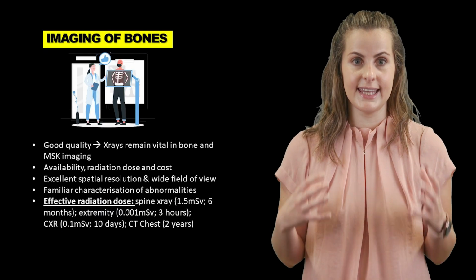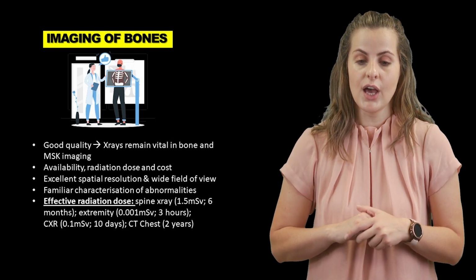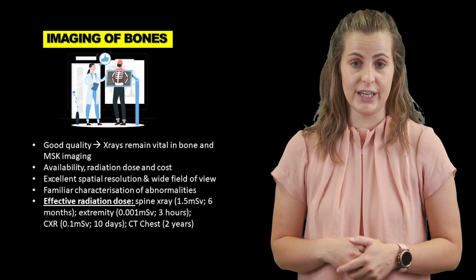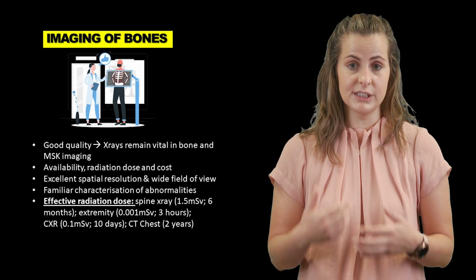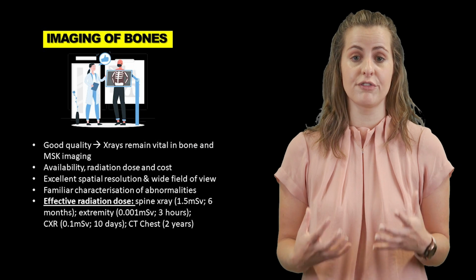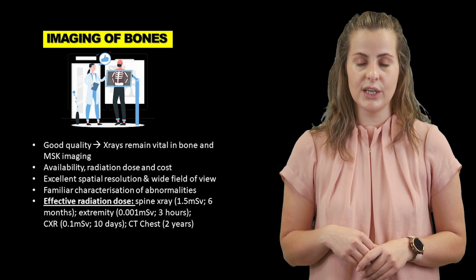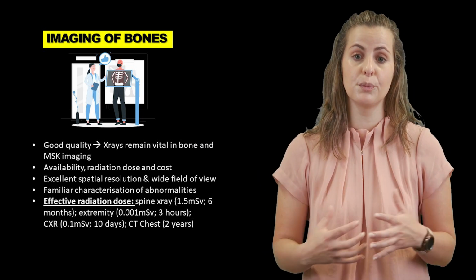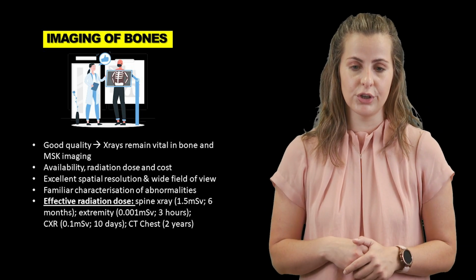If we focus on the imaging of bones, which is the premise of this particular session, our gold standard is always going to be X-rays or plain film radiographs. This modality is probably the most conservative in terms of the first line of referral, but it's also going to be good enough given the purposes of our investigation. So with X-ray, we can clearly see the anatomical structures, the different parts of the bones, the different architecture that composes bone.